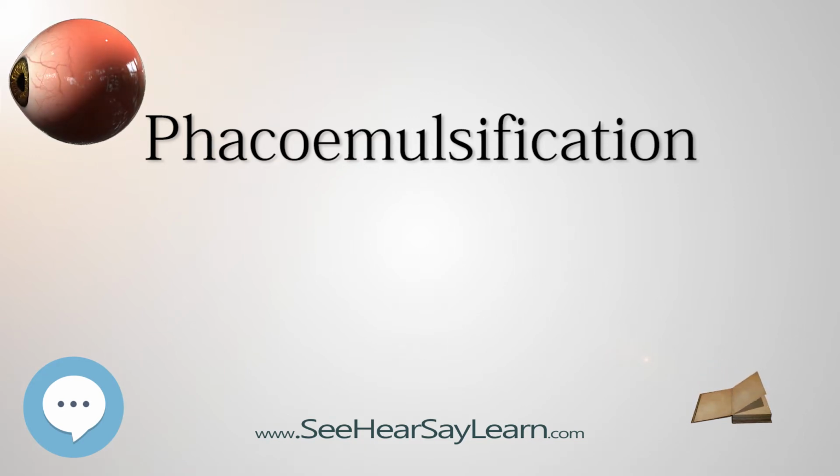The phaco probe is an ultrasonic handpiece with a titanium or steel needle. The tip of the needle vibrates at ultrasonic frequency to sculpt and emulsify the cataract while the pump aspirates particles through the tip. In some techniques, a second fine steel instrument called a chopper is used from a side port to help with chopping the nucleus into smaller pieces. The cataract is usually broken into 2 or 4 pieces and each piece is emulsified and aspirated out with suction. The nucleus emulsification makes it easier to aspirate the particles.